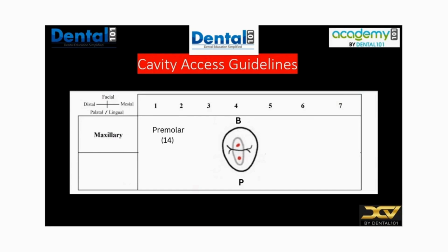Just remember that the criteria, be it whatever tooth, will remain the same. So just follow that and do what you have been doing for the upper molar. The only thing that is going to change is the shape of your access cavity based on the anatomy of the tooth. So let's go over that briefly.